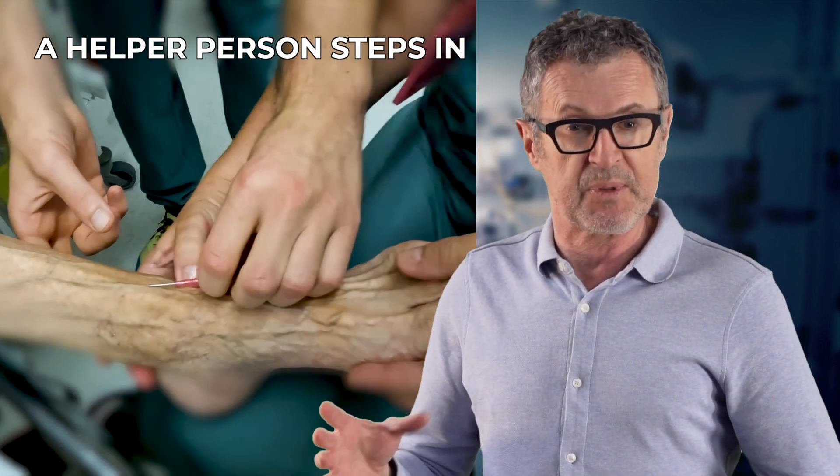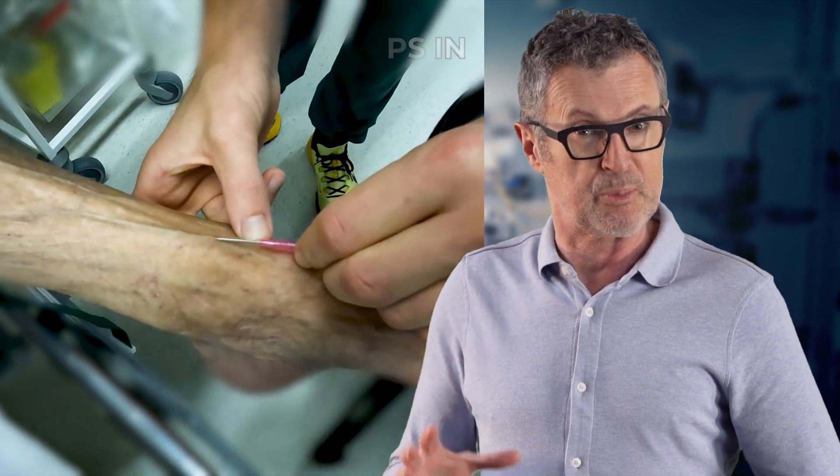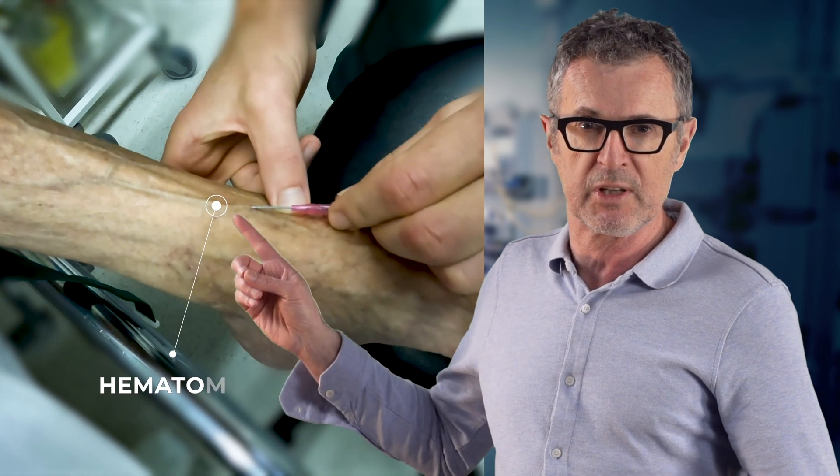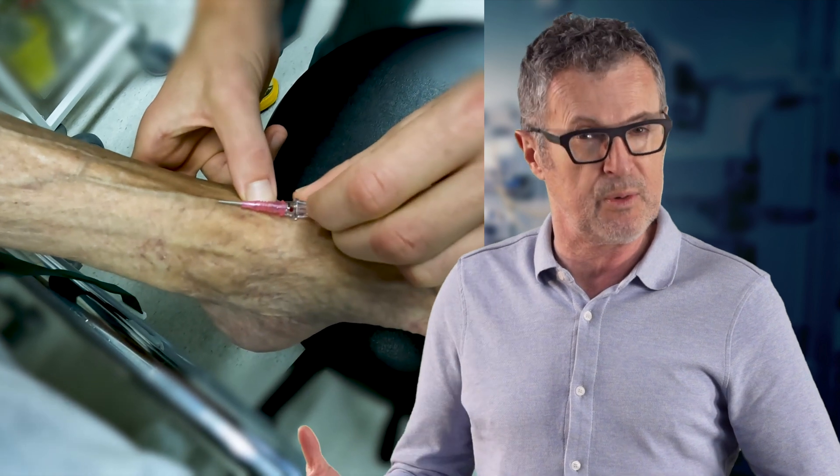The helper person steps in here and tries to save the IV, but the attempts are unsuccessful. As the needle is pulled out, the hematoma starts forming immediately, complicating the troubleshooting and eventually demanding a new attempt at another vein at another site.